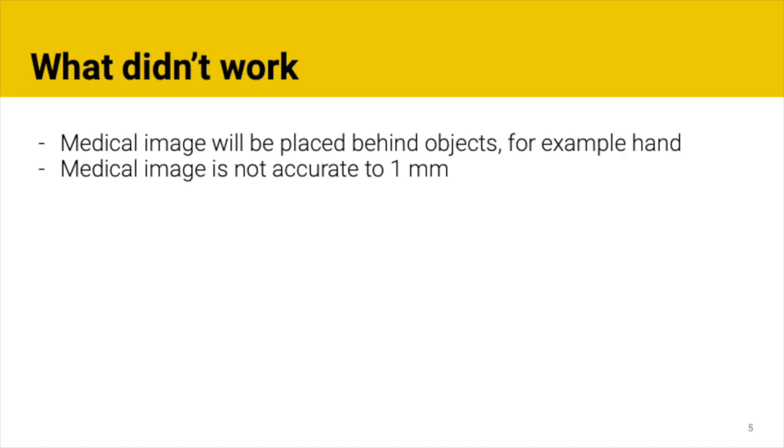One possible way to make the AR image appear behind any real objects is for the app to first recognize and track the depth and the shape of the real objects. Then, the AR image would need to be cropped around the real objects. This needs to be accomplished real time as well. However, as a workaround, there's an option to make the AR image more transparent, which would help the users see their hands or any other real objects. So, this must be used as of now.